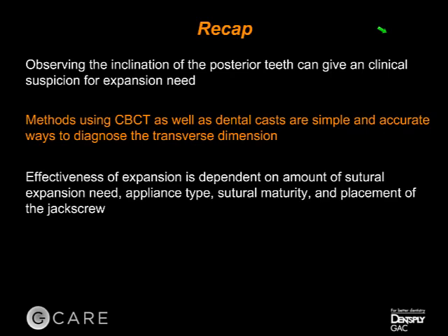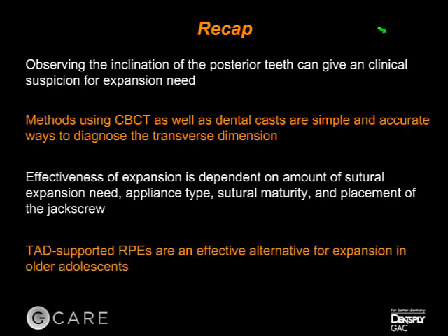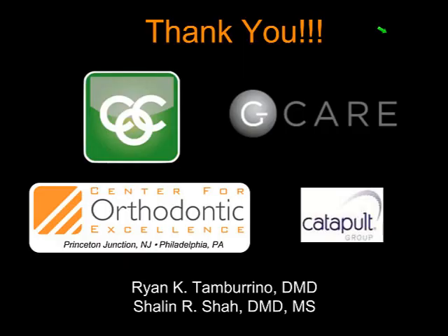Like I said, with the TAD expander versus a conventional expander, we are seeing differences in the amount of sutural expansion, and which we use depends on what need the patients have. And finally, the TAD-supported RPEs, as I've shown, at least in our practice, are a very effective alternative for the expansion in older adolescents.